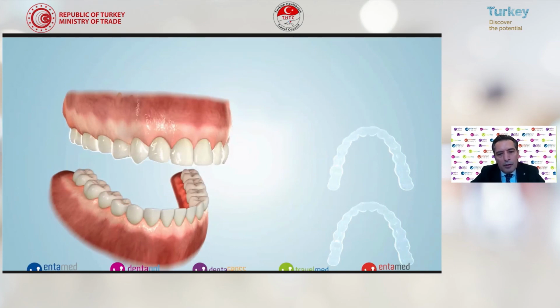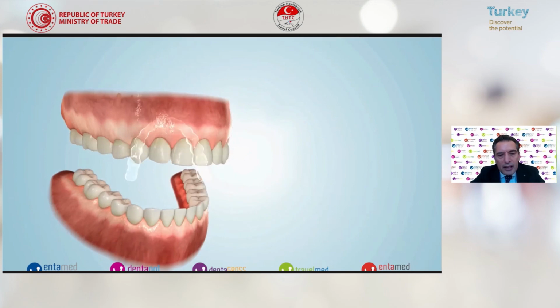You see, you perform the aligners. They are invisible. That's why we call them Invisalign. They are clear aligners. We place them in the mouth, and there is no difference. And the patient can sometimes take them out and replace them again himself.